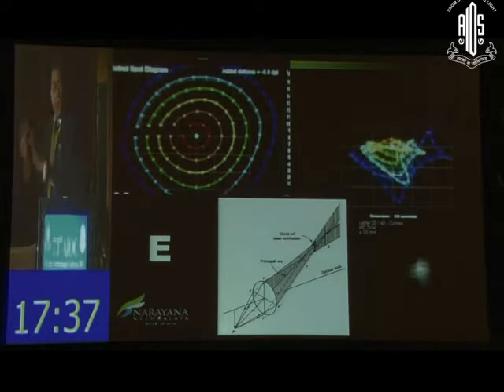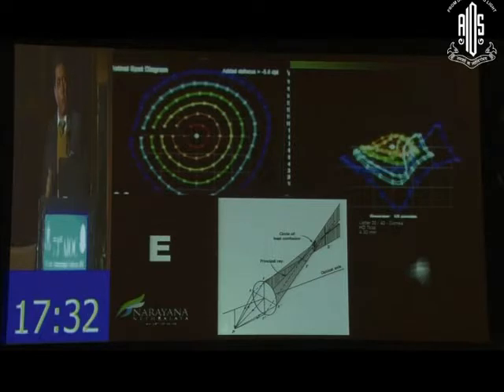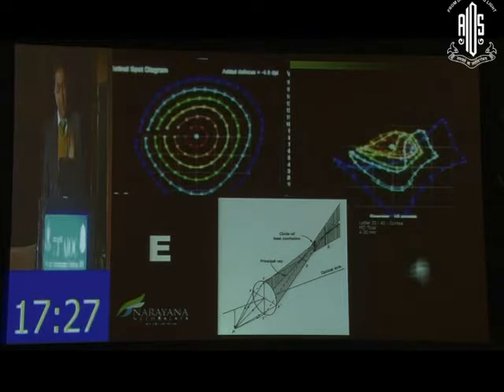And this is actually of a patient. This is not an animation. This is actually taken from an aberrometer of 2 different patients, one with keratoconus and one with a perfect 6x6 good quality of vision.